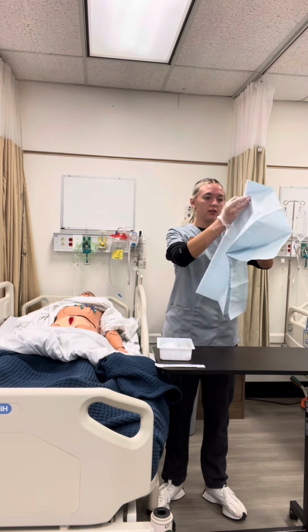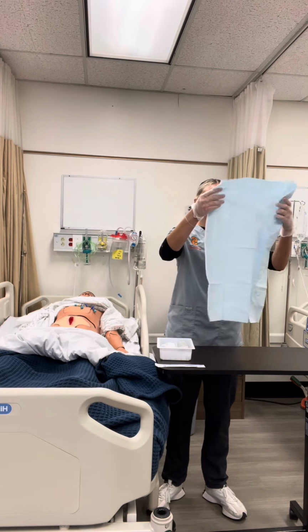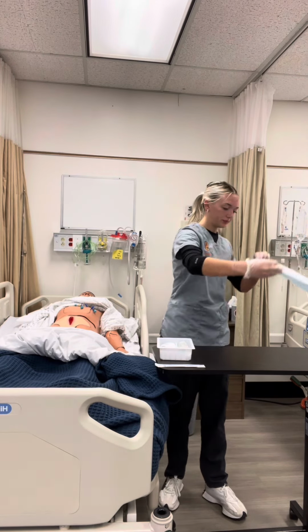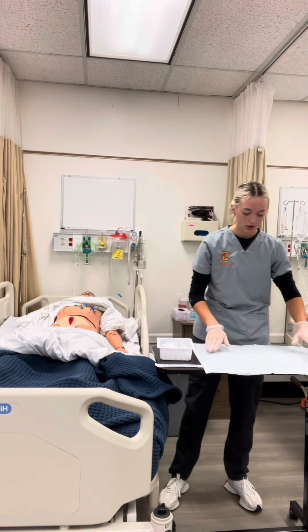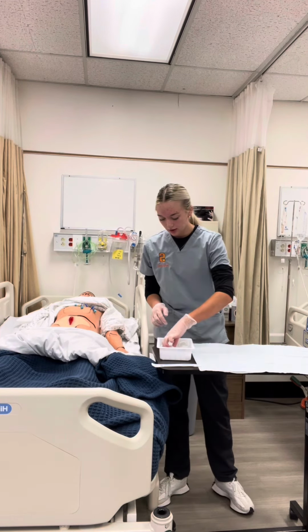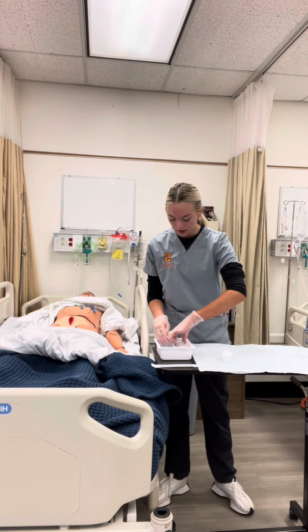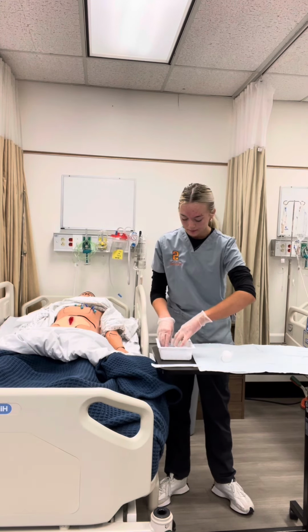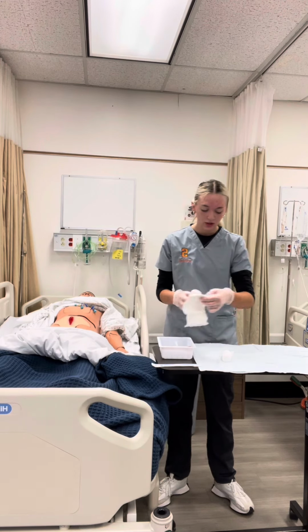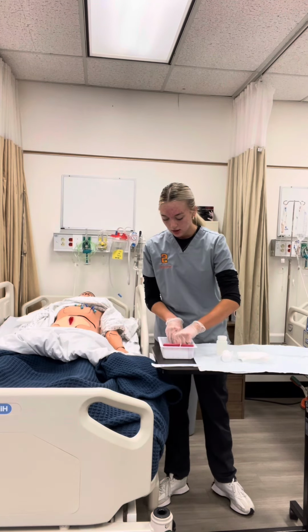So the outside of this is not sterile, so there we go. Okay, so I'm going to observe 1-inch borders. I don't want anything touching my actual sterile field. Here I'm going to lay out my supplies. Just want to be careful not to touch the outside of my kit because it is not sterile.